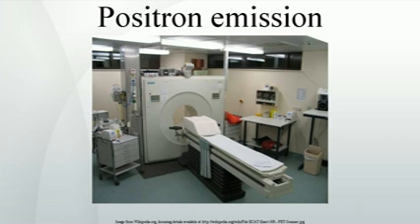The compound was first administered to two normal human volunteers by Abass Alavi in August 1976 at the University of Pennsylvania. Brain images obtained with an ordinary, non-PET, nuclear scanner demonstrated the concentration of FDG in that organ. Later, the substance was used in dedicated positron tomographic scanners, to yield the modern procedure.